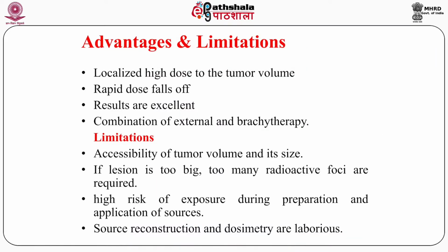The advantages and limitations of brachytherapy: the advantage is a localized high dose to the tumor volume. Since the radioactive source is placed very close to the tumor, the dose to the tumor region or tumor volume is very high. And in brachytherapy, the dose reduces very sharply with distance.